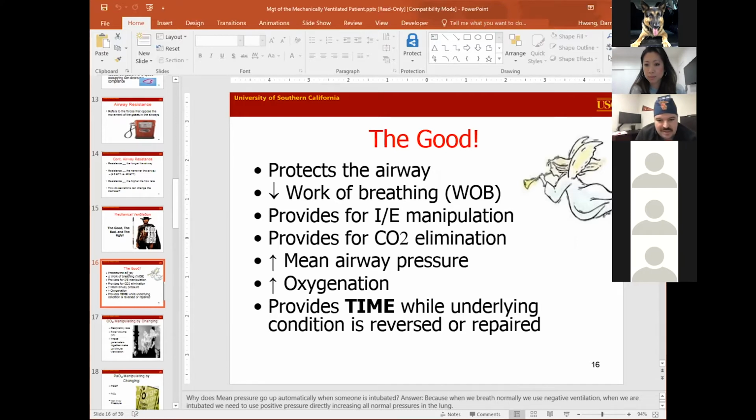So the advantages we get out of this are control. We can isolate the patients this way by getting a closed circuit with filtration. It's an advantage in treating COVID since PPE as a whole is not totally effective. Isolating patients is key. There's some discussion around early intubation being good and bad, and I don't think we'll know until all this is over. Let's go ahead and continue.